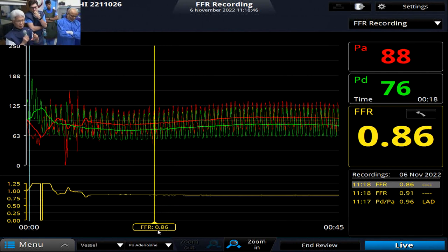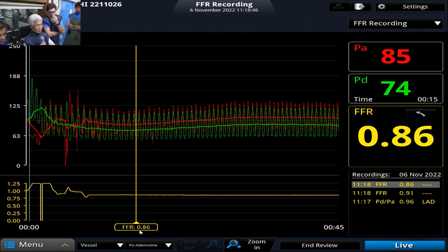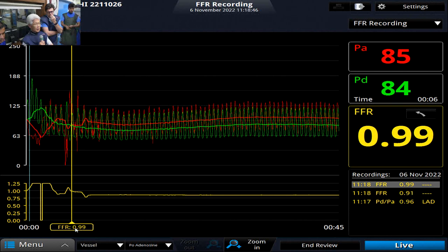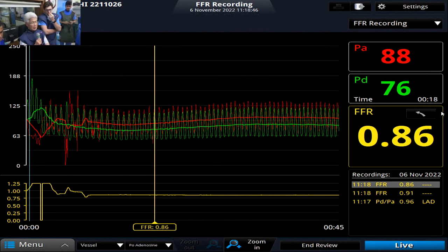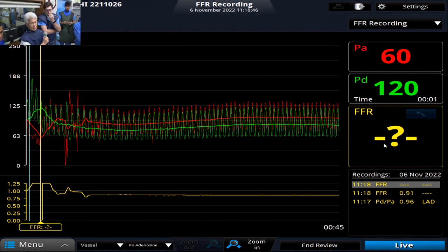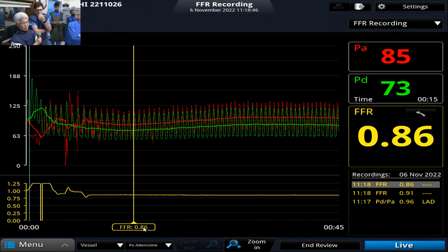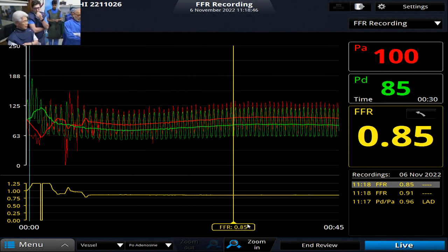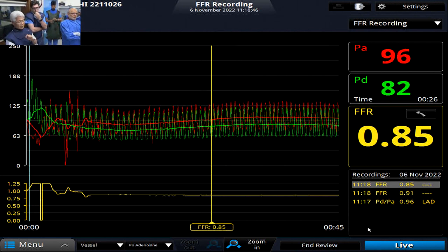If you decide the final conclusion, it is important to add a little bit higher dose, finally. If it is the same, that is the final conclusion. One of my partners and I are actually looking at this in a systematic fashion now, looking at IV in comparison to intracoronary and at what dose the receiver operating characteristics reflect an optimal differentiation between hyperemia and lack thereof. But it's not an easy study to do.